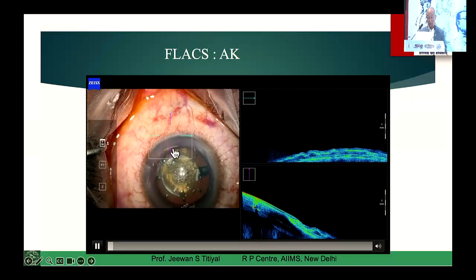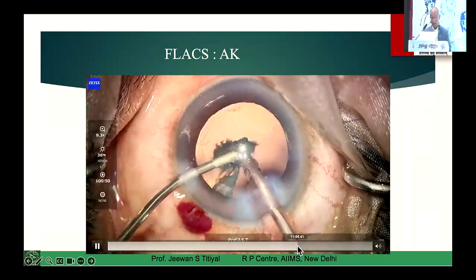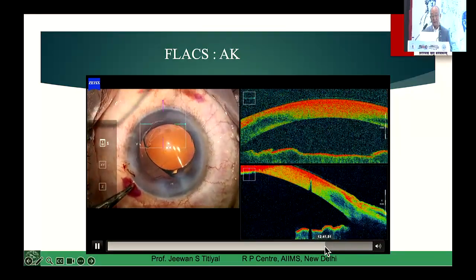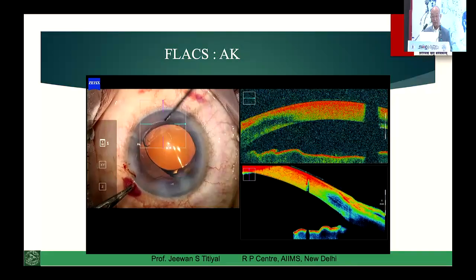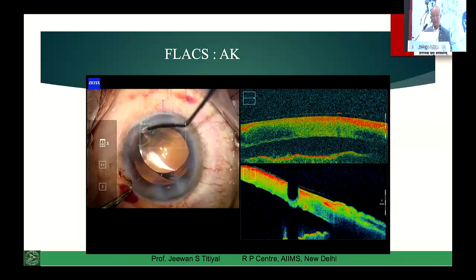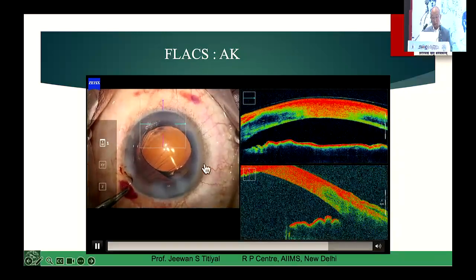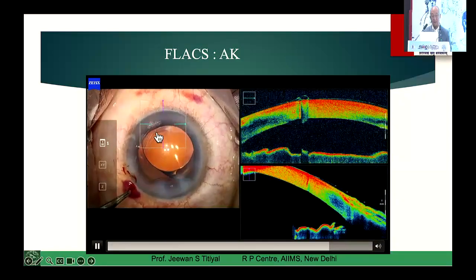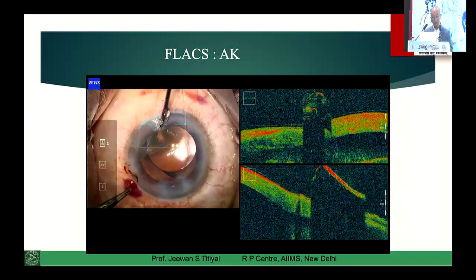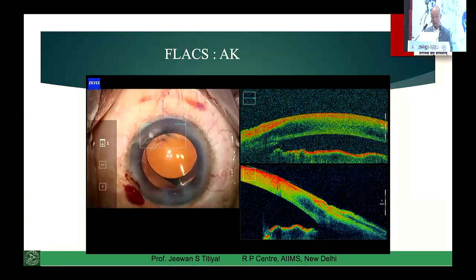So this is the arcuate incision we have created. I'll take you towards the end of my surgery. So once we complete the surgery, I'll implant the IOL. So under the viscoelastic retention, then go there with the spatula vertically down and open this incision. The idea here is that the chamber should be formed with a viscoelastic so that you can manipulate this. This is a smaller incision. If I have a slightly larger incision, I use this separator, which is open like we used to do for RK in those days, a wound separator, which will give you the depth of incision also.